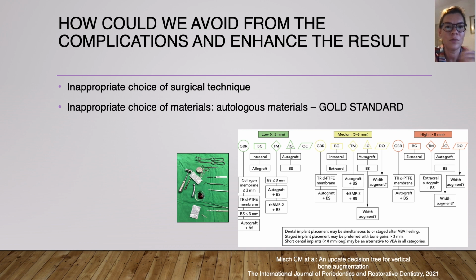How could we avoid the complications, the patients and ourselves as well? I think that it is very important the appropriate choice of the surgical technique and the appropriate choice of the materials that we use during the surgery.